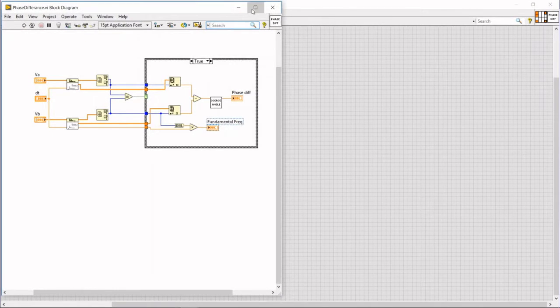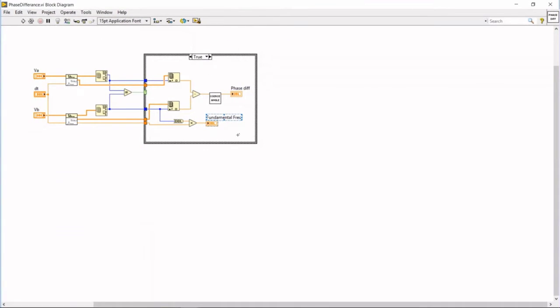Okay, so what is fundamental frequency? That is the frequency at which is placed maximum of our amplitude magnitude spectrum. So if the frequency of the maximum spectrum for VA and VB is the same, then we are going to calculate the phase difference. In other case, we are not going to calculate anything.